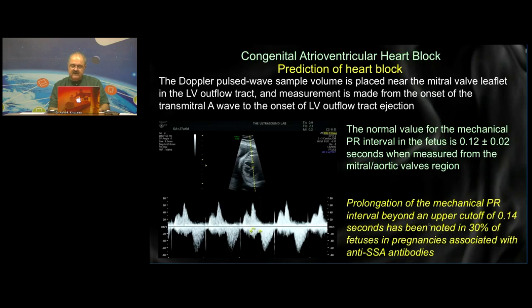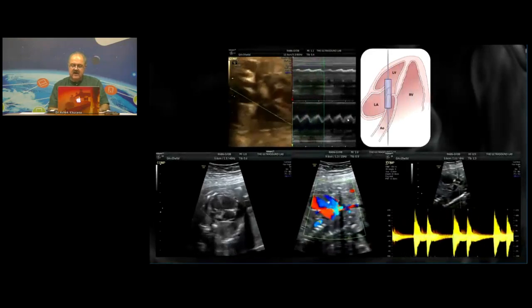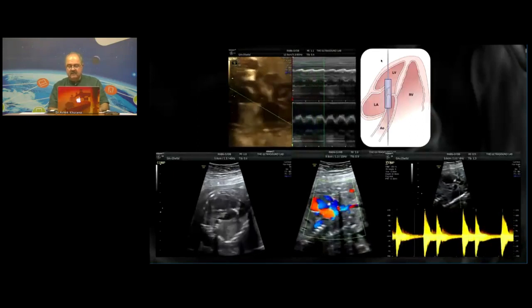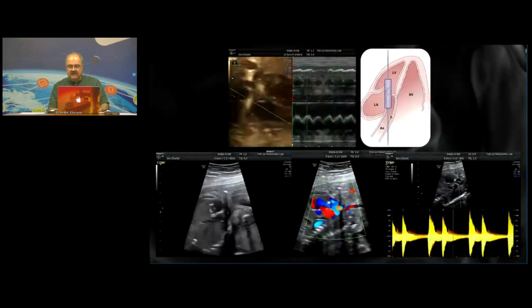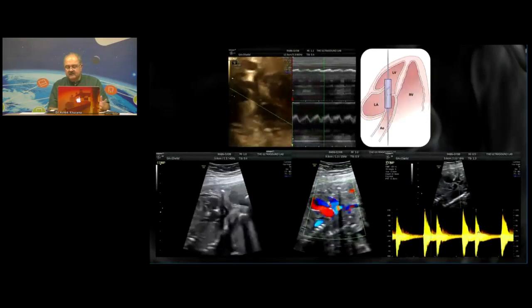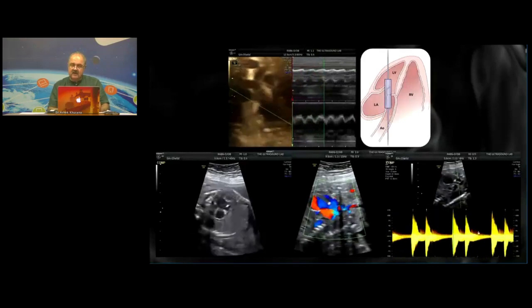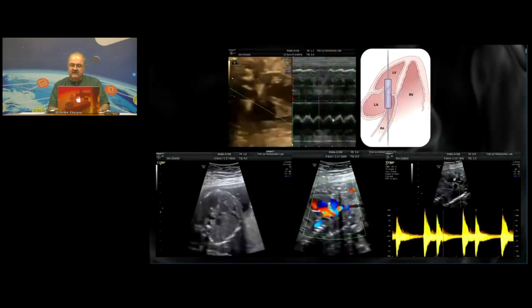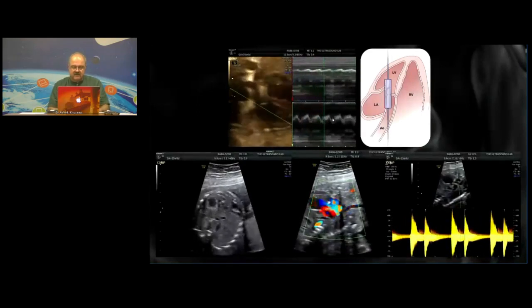Remember that it is quite tricky to actually get neat, clean outlines on M mode, and it's very easy if you place the transducer like this, which means I'm including one leaflet of the mitral valve and including one leaflet of the aortic valve, and then I get nice clean ones here. Simple things like bigeminy and so on. But truly speaking, anywhere where I want to look in arrhythmia, I now use a flow parameter such as Doppler. I don't use M mode, which is actually anatomy mode or motion mode. I actually use Doppler to assess this.